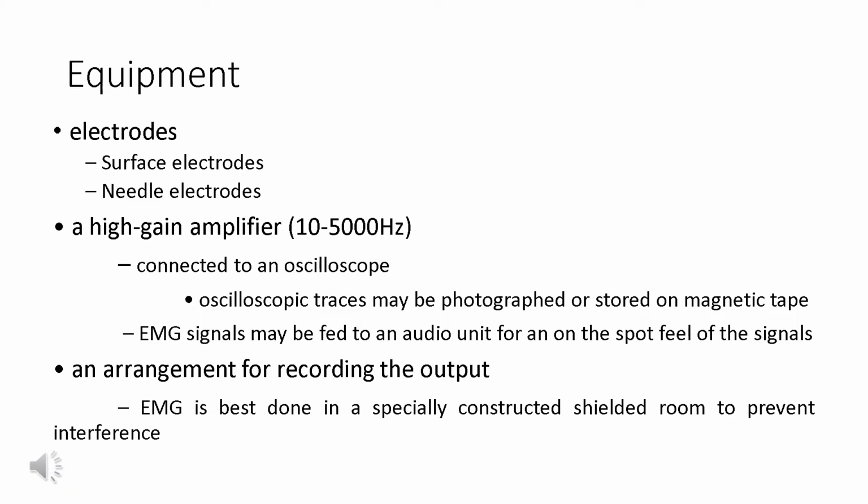There are two kinds of EMG: surface EMG and intramuscular EMG. Surface EMG assesses muscle function by recording muscle activity from the surface above the muscle, on the skin. Surface electrodes are able to provide only a limited assessment of the muscle activities. This can be recorded by a pair of electrodes or by a more complex array of multiple electrodes. More than one electrode is needed because EMG recording displays the potential difference, or voltage difference, between two separate electrodes.